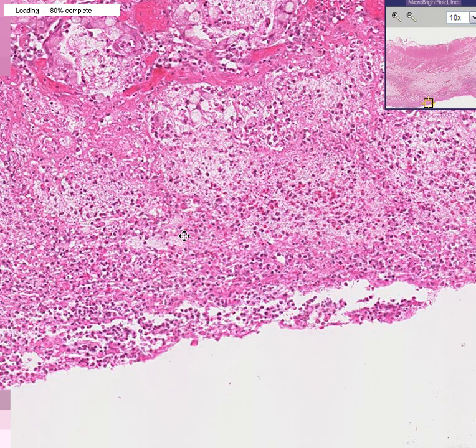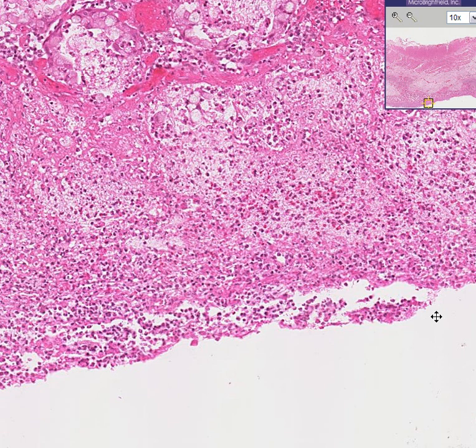Theoretically, any superficial scab on a colon for any reason could result in this appearance of pseudomembranous colitis. In reality, however, 90 percent of the time this is caused by an overgrowth and bacterial toxin from the bacterium Clostridium difficile. So pseudomembranous colitis is generally regarded as being caused most of the time by Clostridium difficile toxin.